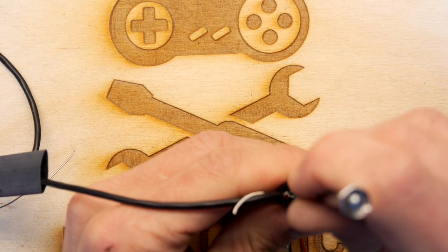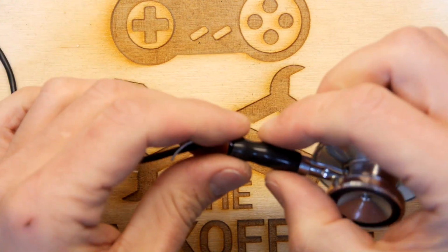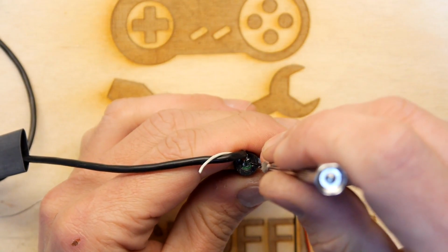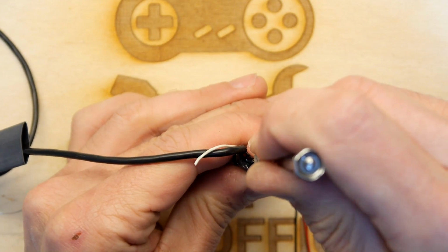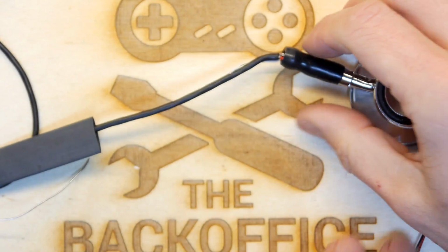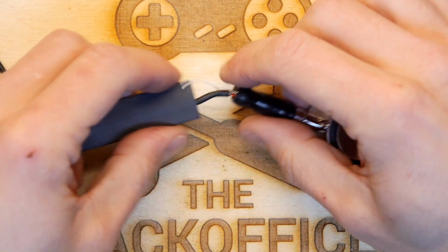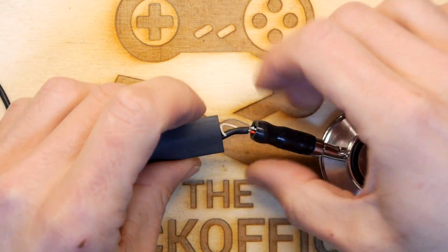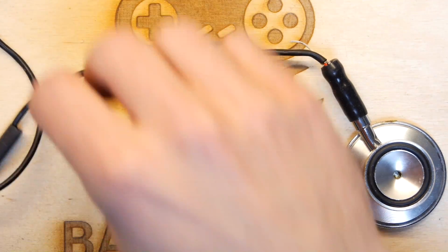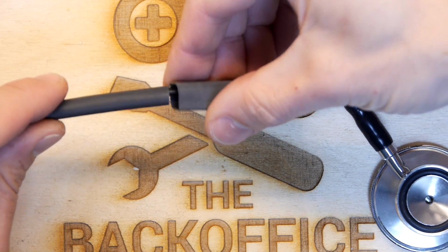Now, traditionally, doctors do listen in several areas, so I'm wondering if you could have maybe more than one of these probes running, if that had any benefit at all. Be a bit gentle as well when you're pushing the PCB down. You really don't want to damage that element inside it. Hot air on. I'm going to put the heat shrink on. That though, I want the smaller heat shrink first, so I've got to do a bit of trickery here.